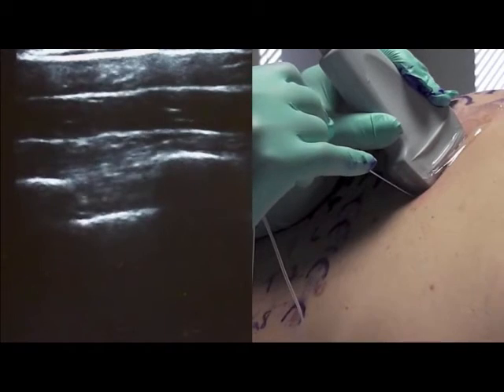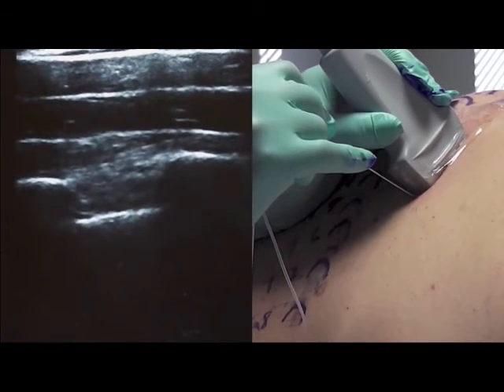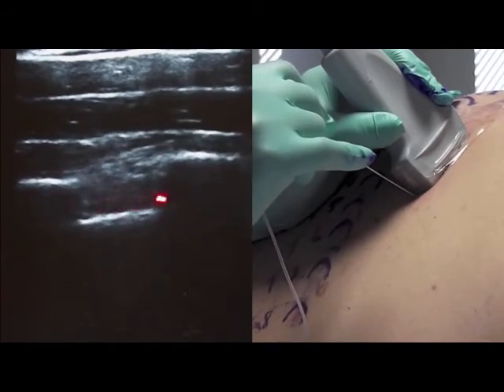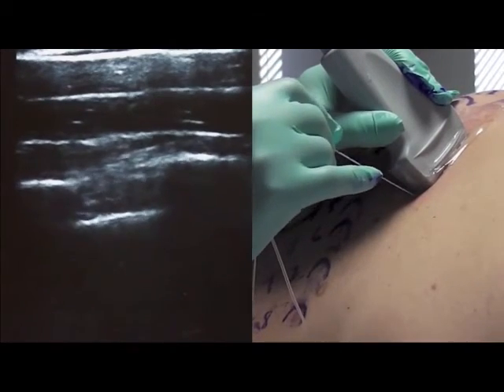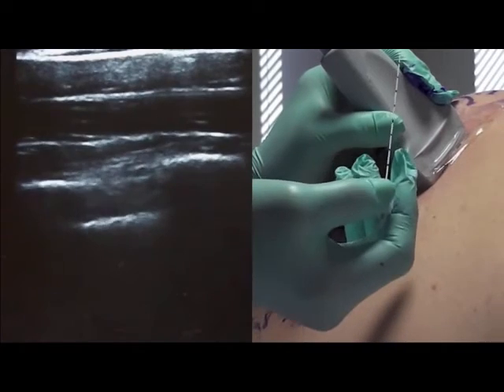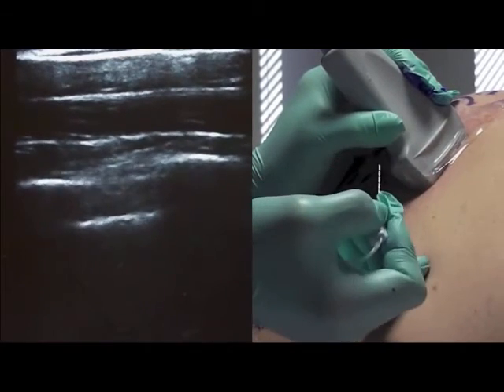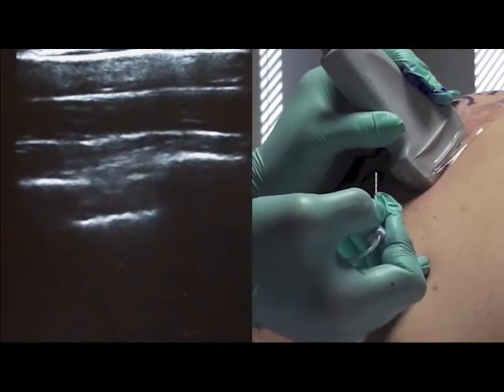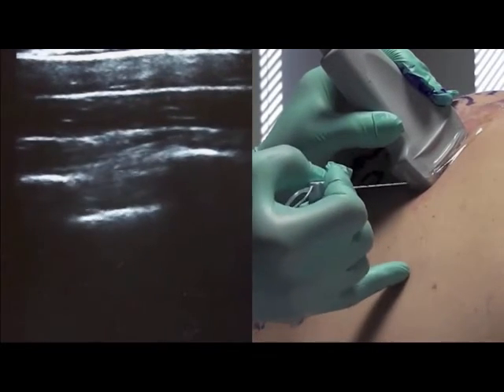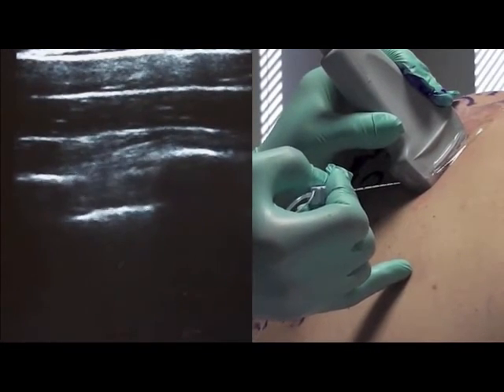Looking at the screen, I would expect the paravertebral space to be at about four centimeters. If I got to five or six centimeters with this needle I'd start to get concerned that the needle is not where I thought it was and could be violating the pleura. The incidence of pneumothorax with this block is less than one percent, so it is relatively very safe, but pneumothorax is always a potential complication.